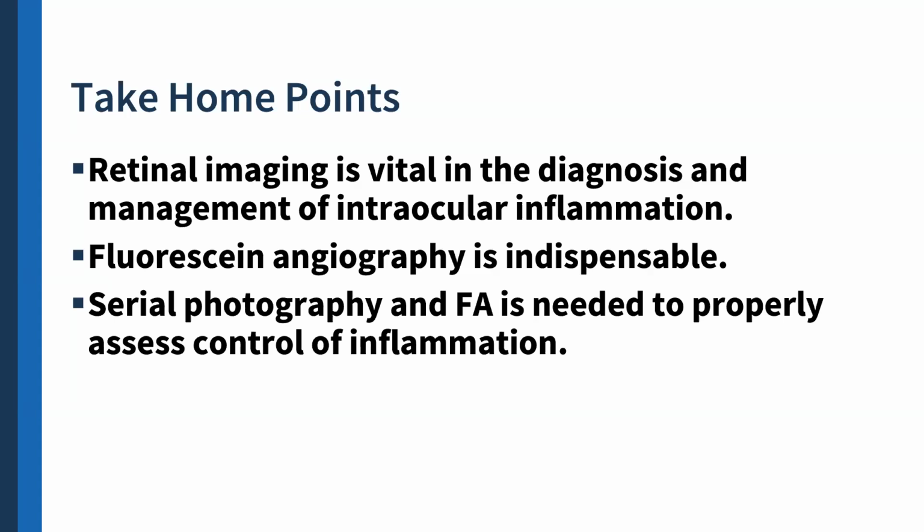It's indispensable, and most of the time you even need to do serial photography and angiography, roughly, depending on the person, every 4 to 6 months, sometimes even every 3 months, to properly assess the control of the inflammation. Okay, that's my last slide. Thank you.